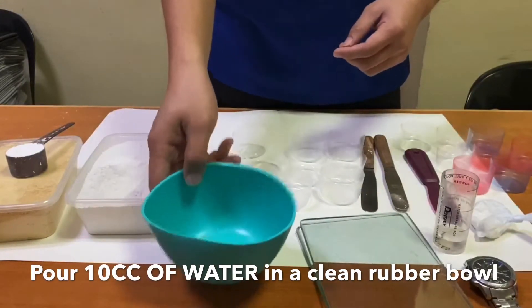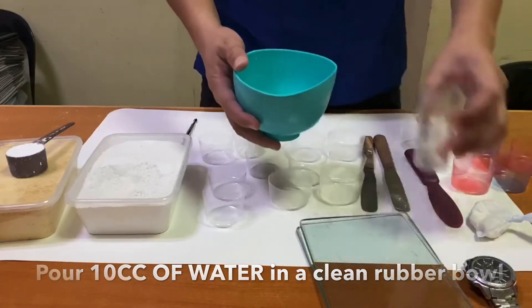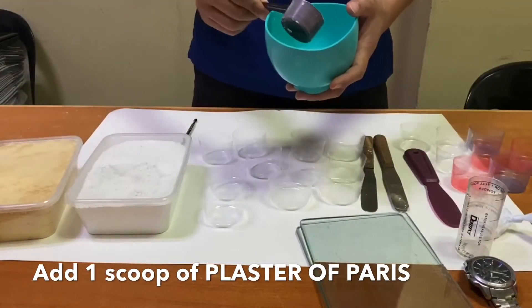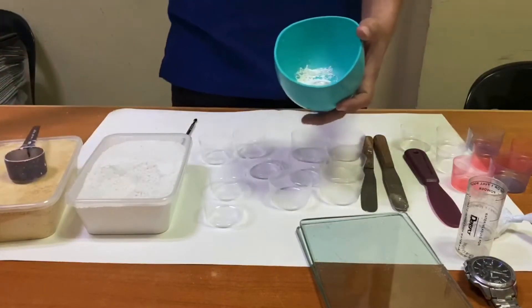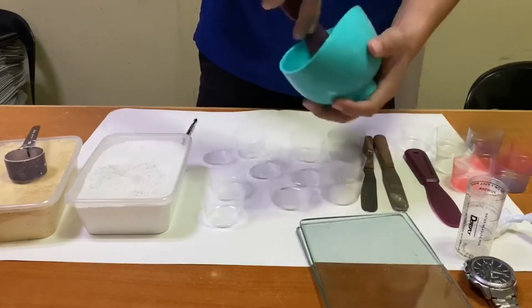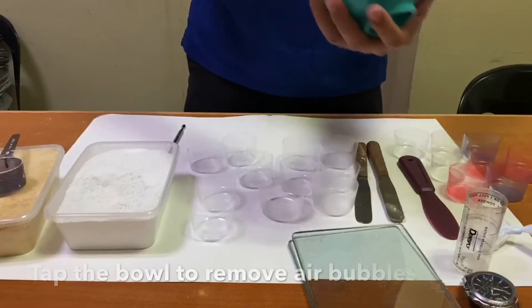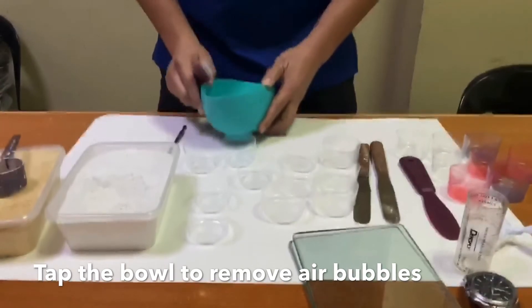In a clean rubber bowl, pour an amount of water at room temperature. Then put one scoop of plaster powder into the bowl of water and start mixing for one minute. Tap the rubber bowl for 30 seconds just to remove the air bubbles.